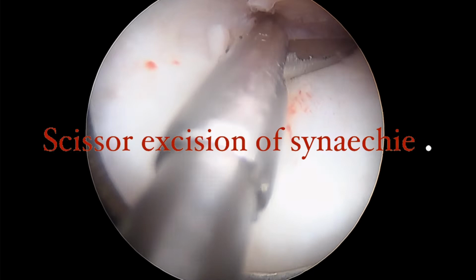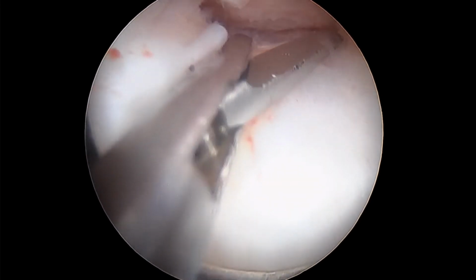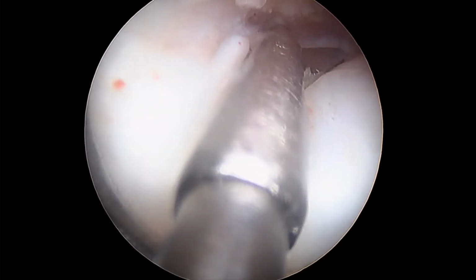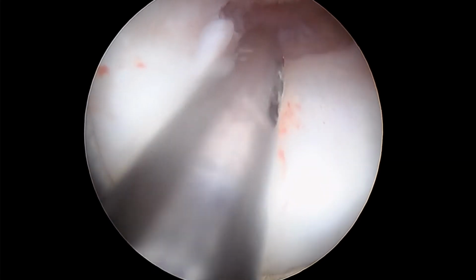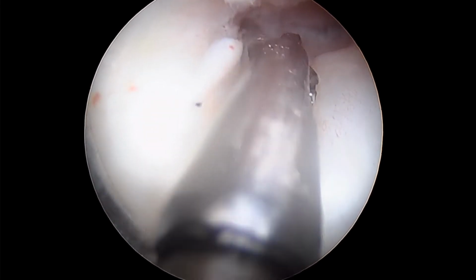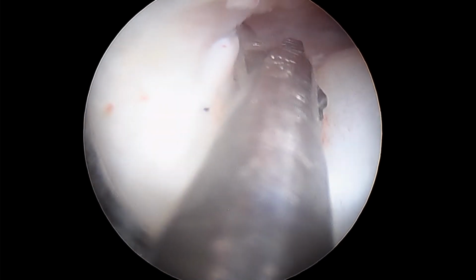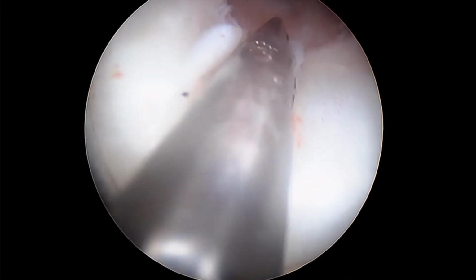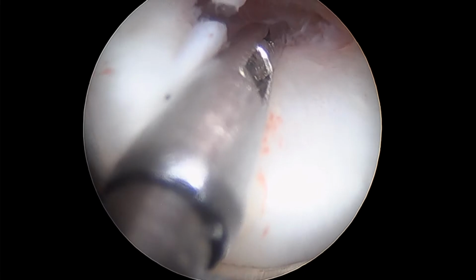It is usually preferred that you use scissor dissection or scissor excision, and try to avoid energy in the treatment of Asherman syndrome. You need a very good image, because the risk of perforation is usually high. The technique is that you start from the internal os and you gently excise the adhesion.